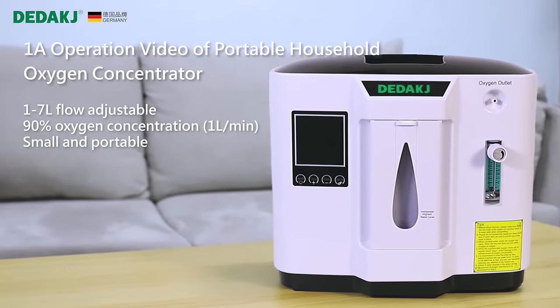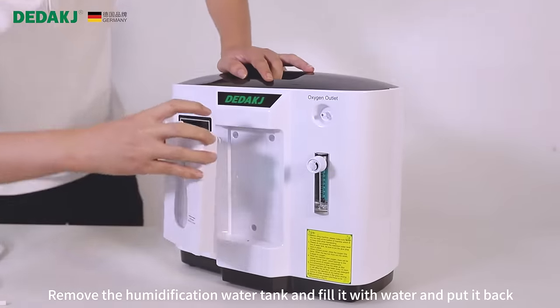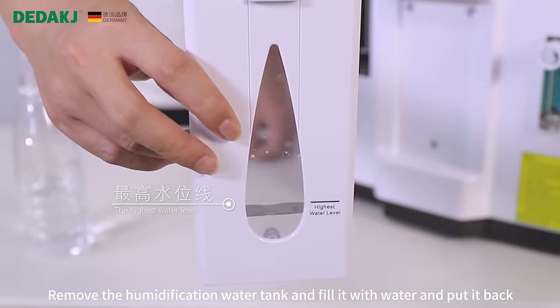One operation video of portable household oxygen concentrator. Remove the humidification water tank and fill it with water and put it back.